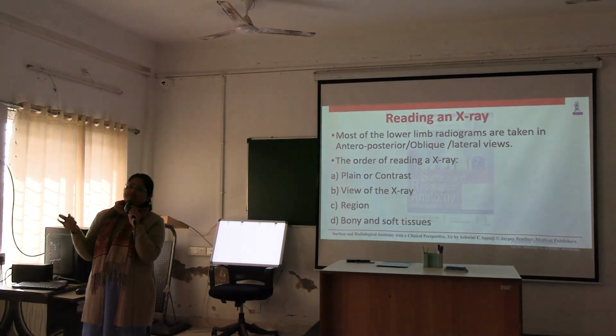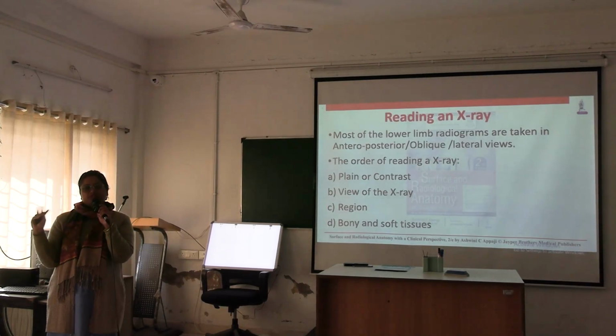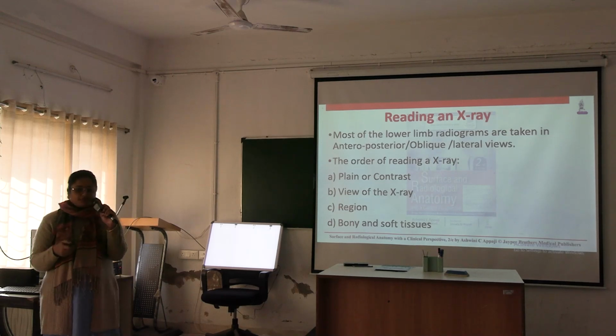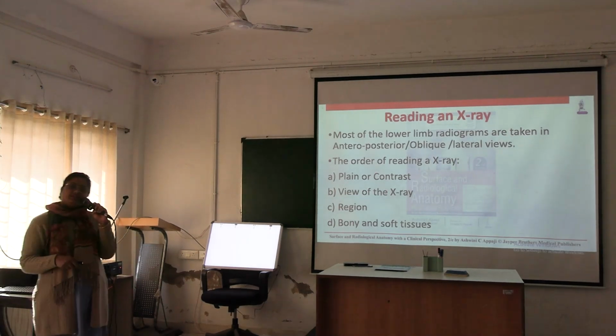Okay, these are the points we have to remember while describing an X-ray. One X-ray must come in your OSPE questions. Whichever X-ray you are given, you have to first describe the X-ray, point out the structures, and answer the related questions. First you have to know whether it is a plain X-ray or a contrast X-ray.